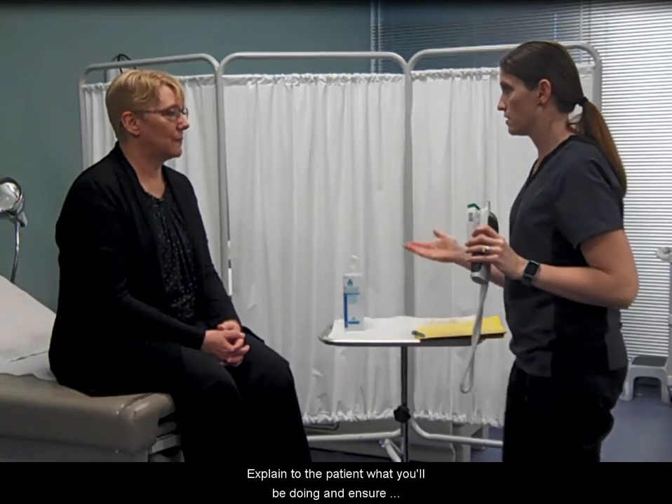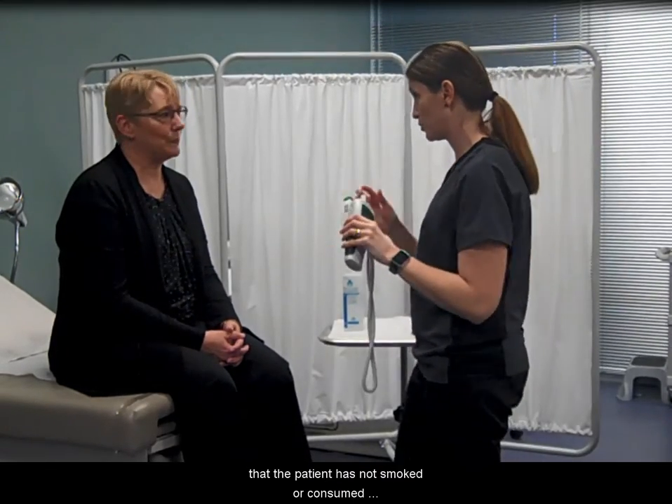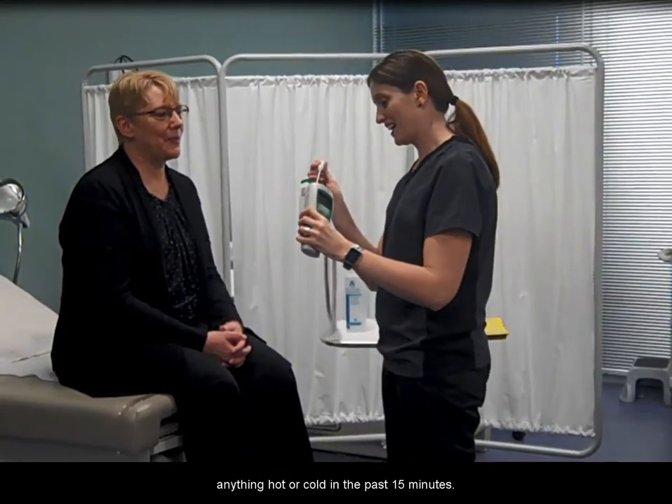Explain to the patient what you will be doing and ensure that the patient has not smoked or consumed anything hot or cold in the past 15 minutes.